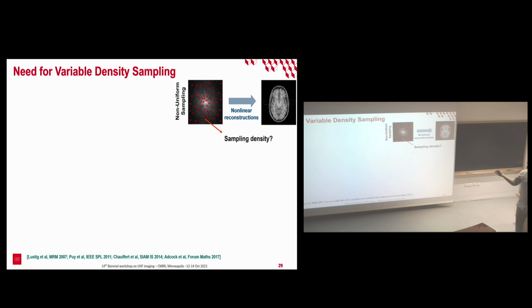And of course, if you project back into the time domain for 1D signals, you get back a sinusoid. Making an incoherent sampling will basically consist in randomly undersampling your signals as much as you can, to avoid the artifacts we obtain by doing a regular and deterministic undersampling, which we observe with the Nyquist criteria. So we're going to try to spread the measurements we collect to limit the artifacts at the reconstruction stage. And basically, a key tool to do that is to implement pseudo-random undersampling in the acquisition space.